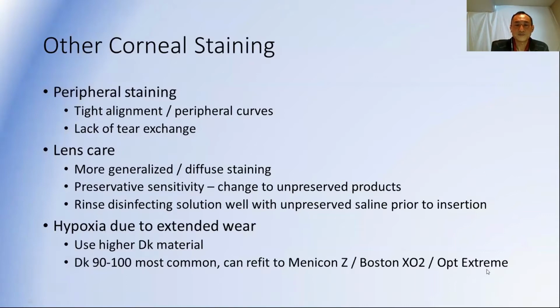A little bit off topic, but you mentioned sleeping on the eye could change the lens from properly working. Could sleeping on the eye give more astigmatism without Ortho-K lenses? Good question. I'm not really sure. I know just pressing on your eyes through your lids can change your refractive error, so I suppose that's possible. If you have a really tight, thick upper lid, sometimes you get that topography where you have a low steep zone because of that. So I'm sure sleeping on the eye can cause changes in corneal topography.